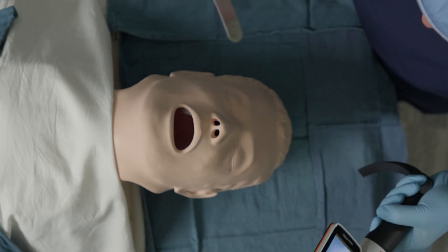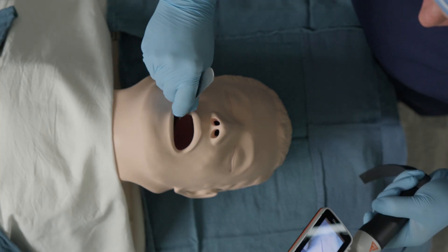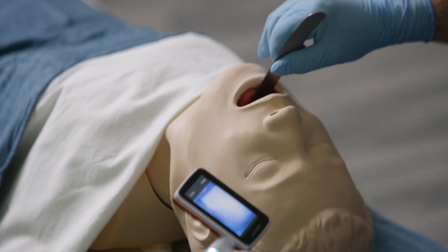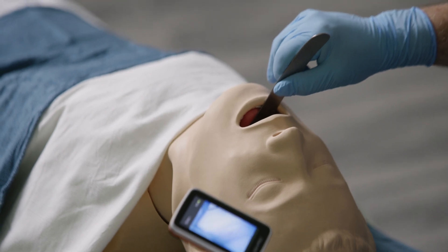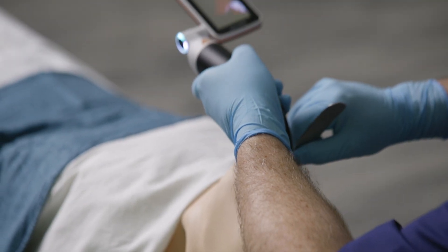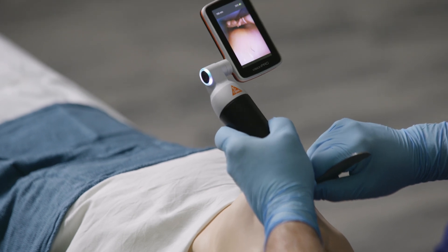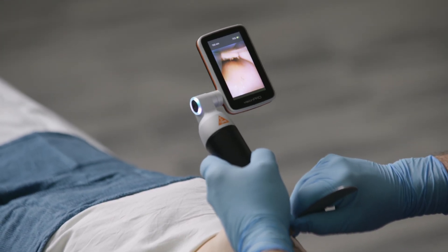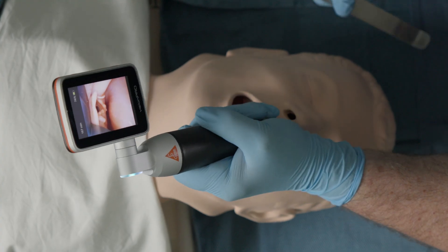So I'm going to demonstrate the use of a tongue depressor. In this case, I'm using a dentistry stainless steel tongue depressor. I'm going to push the tongue into the floor of the mouth, which also opens the mouth very well. It distracts the mandible inferiorly and allows me to place the laryngoscope over the top of the tongue depressor itself. I'm going to go to the vallecula, and now I'm going to remove the tongue depressor.